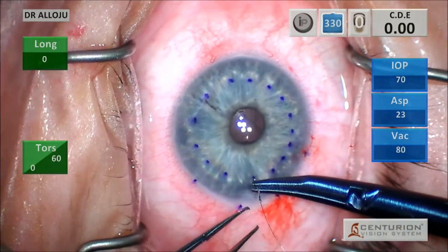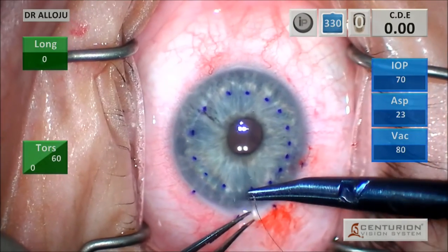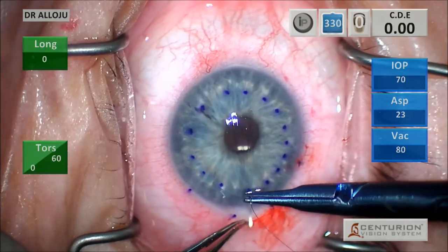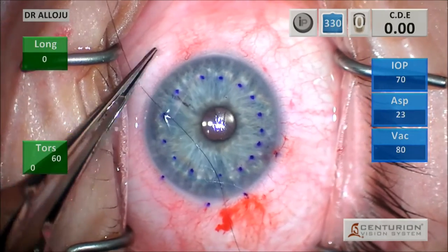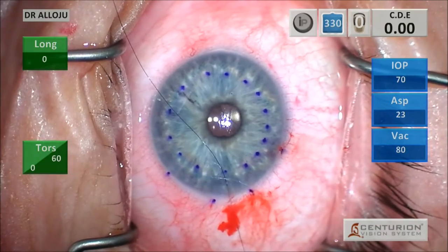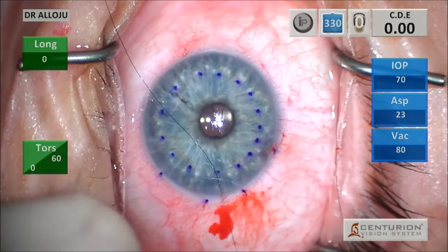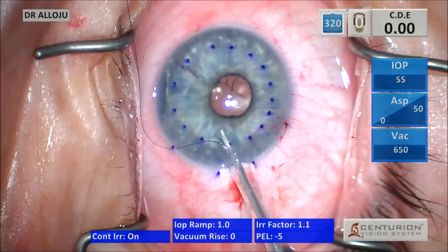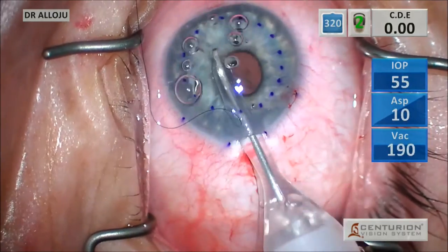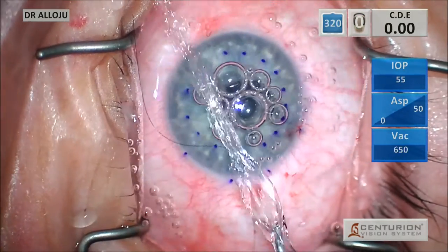Next, I actually like to suture my main wound, but not tie it. I do this now because I've had one instance of air traveling behind the pupil, and I've also had a heme traveling into the eye at the time that I placed my suture, and I find that this step saves me a lot of grief.